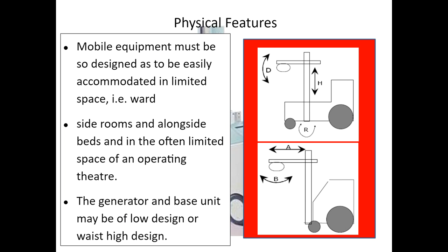So the mobile equipment, of course, is designed to be mobile and move around, but they're big and bulky and they don't go down steps. Always be careful getting into an elevator with the portable machine. The elevators don't always line up perfectly when they hit the floor. If you're a person, you just step on over. But I don't know how heavy the portable machine is. It's heavy though, right? So I wouldn't push it over the bump of an elevator. Who knows what's going to happen?